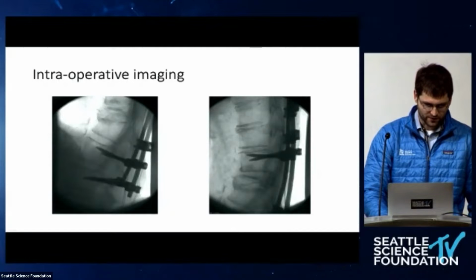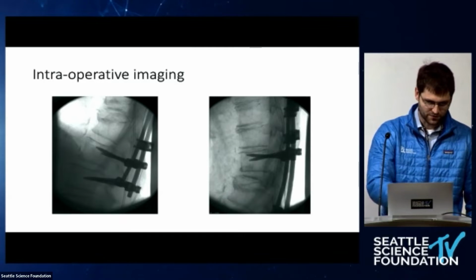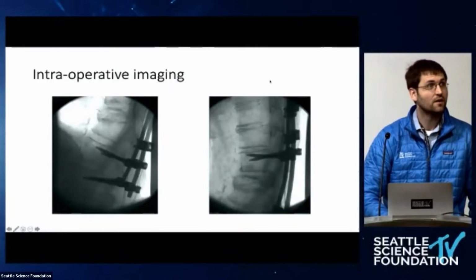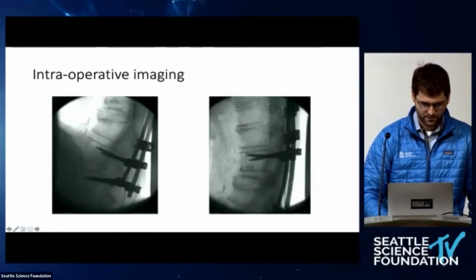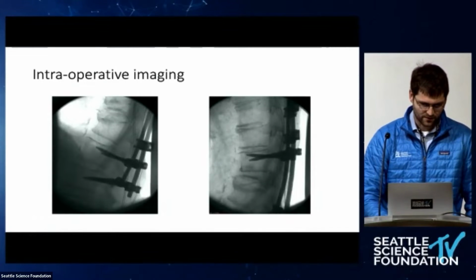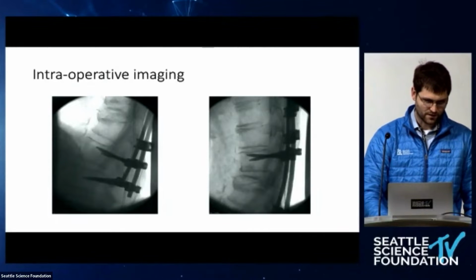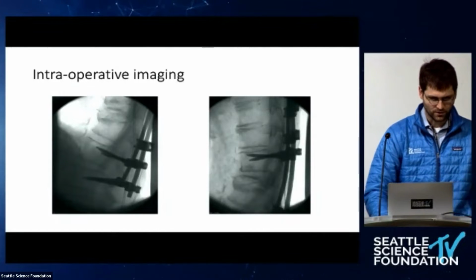There were pedicle screws placed at T11, but none above at T10 or T9, just anchors. And then at the bottom, no screw at L1, but screws at L2 and L3, which were a little short there.